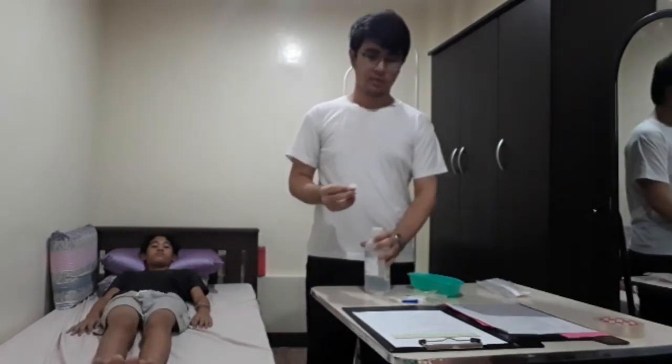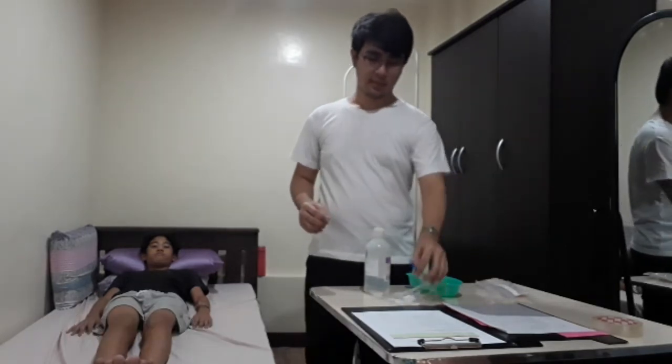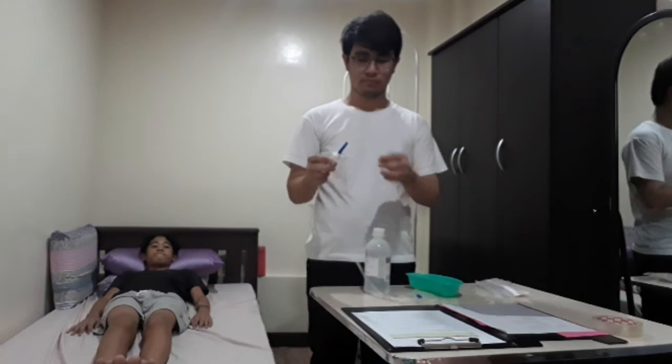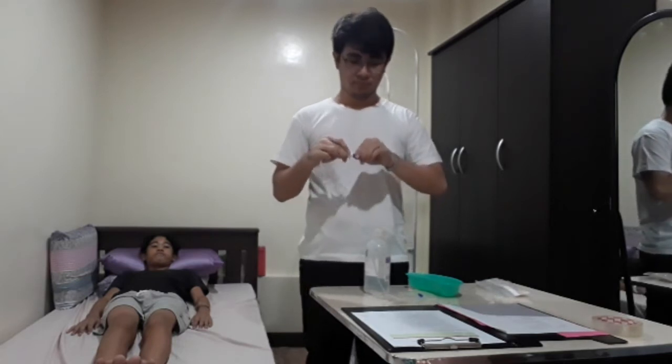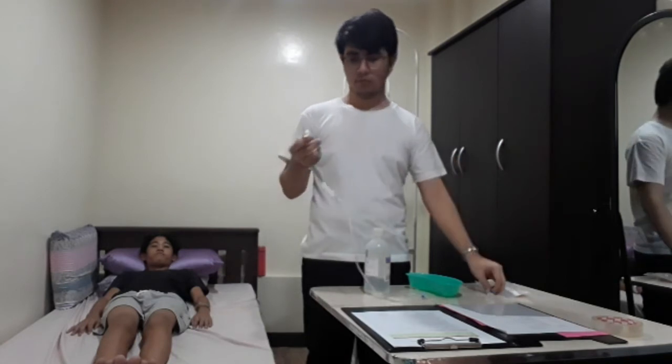So now we will use a twisting and pushing motion and firmly spike the IV container at the entry port. So we'll now spike it.